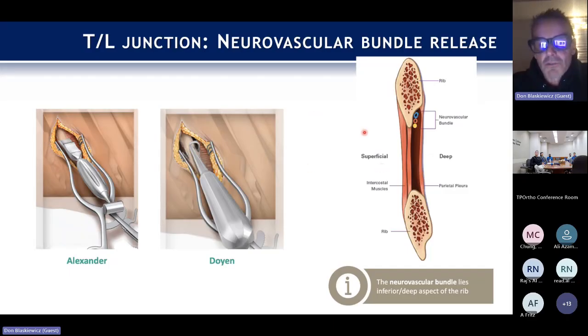And then once you get the rib off, just remember these guys underneath there. And as you're coming under the rib, remember it's not just a round thing, but it's actually shaped like this. So next time you go out for barbecue, take a moment and look at that rib.